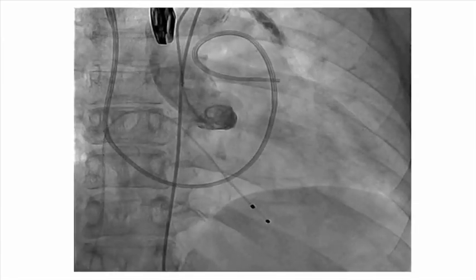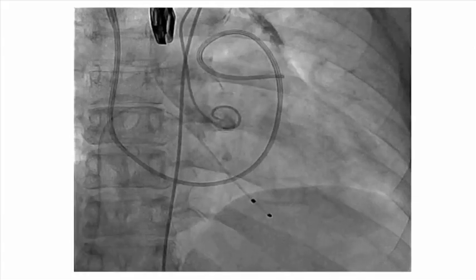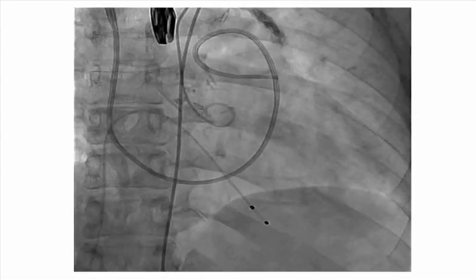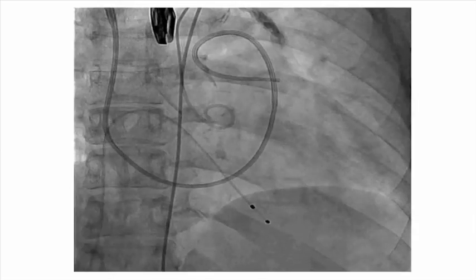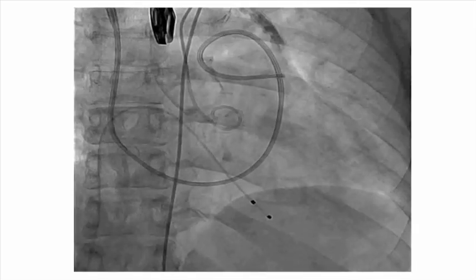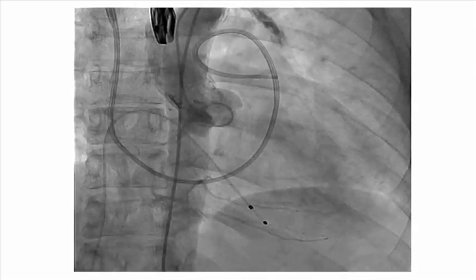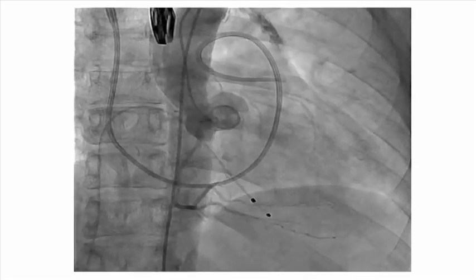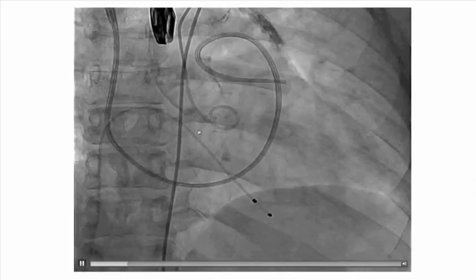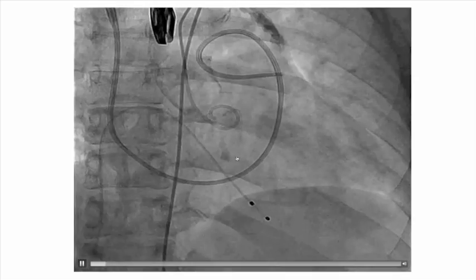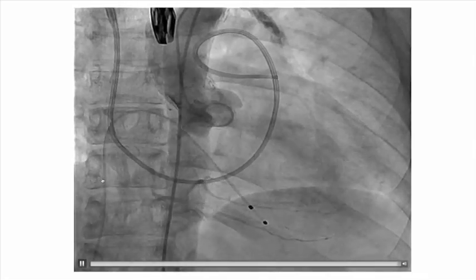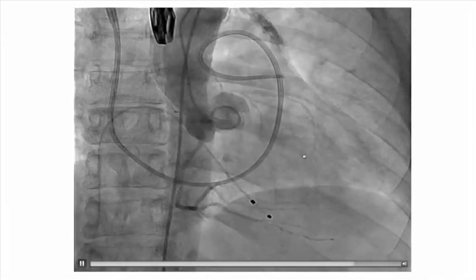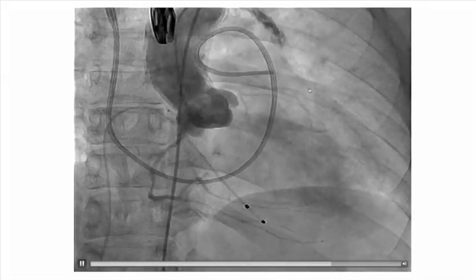A patient would typically undergo an aortogram at the procedure. They are brought into the hybrid OR, intubated and sedated, with access through the groins. The valve delivery access may be through a cut-down performed by the surgeons, or done percutaneously under ProGlide Perclose sutures. We have the pigtail in the ascending aorta, an aortogram showing the three sinuses in alignment, a Swan-Ganz catheter in the pulmonary artery, a 5-French pacing catheter in the right ventricle, and a TEE probe for intra-procedural imaging.